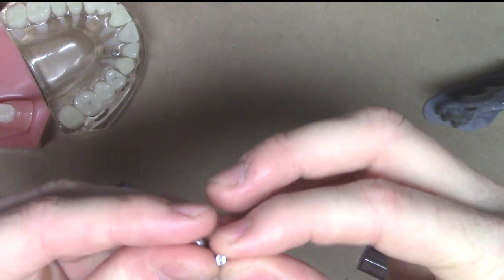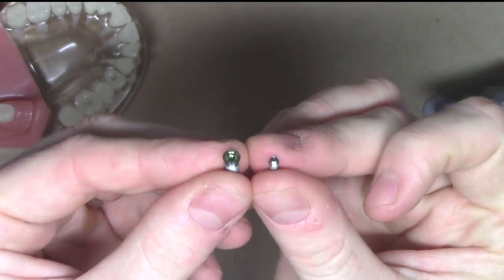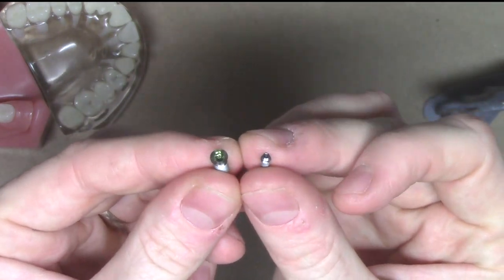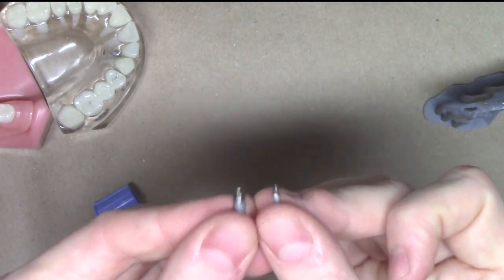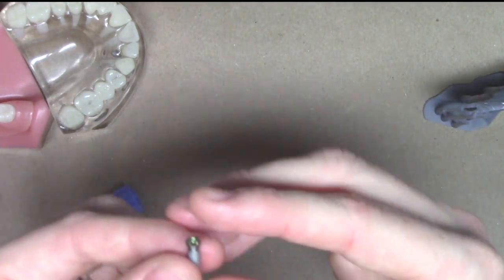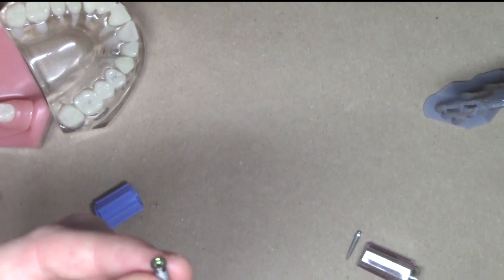As we also look at the platform, like I just mentioned, you'll see here that you have this internal connection on the left, and on the right we have more of an external connection, and that's the case with the LODI implant. As we show you with the standard, I'm going to zoom in just a little bit more.